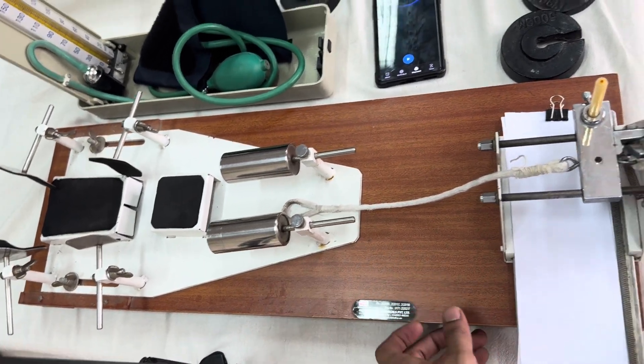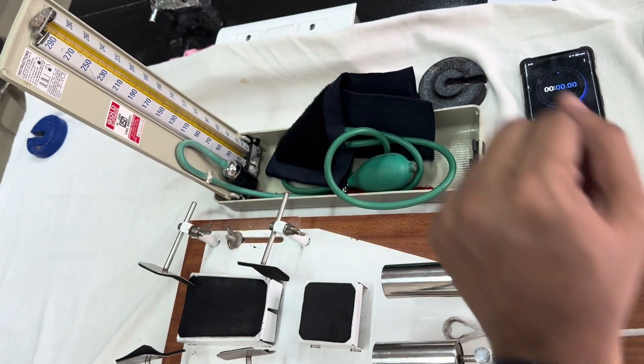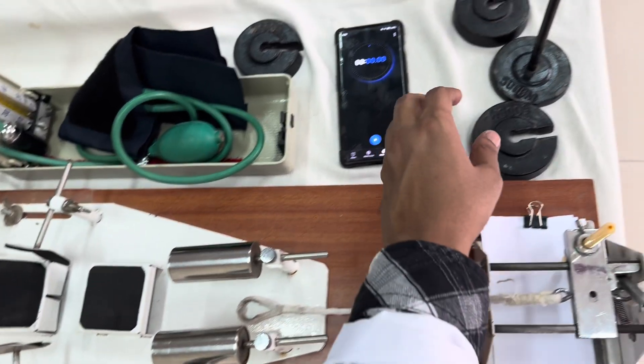This instrument is known as Mosso's Ergograph. We will discuss its parts. We also require a sphygmomanometer, which is the blood pressure measuring device, and a timer or a metronome. If a metronome is not available, you can use a timer, and you will also need weights.